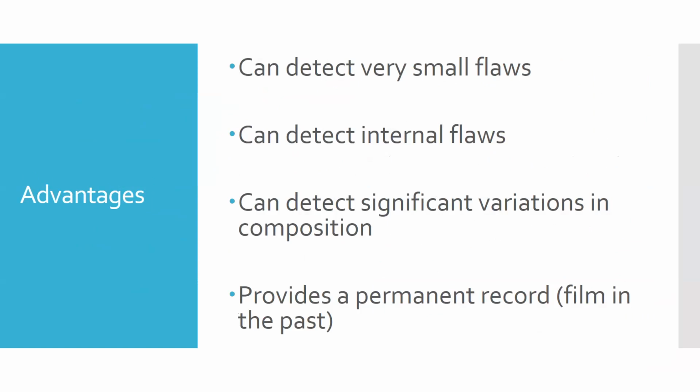And then in the past, originally this was all done with X-ray film. We used film as our detector source. And that created a relatively permanent record. Nowadays, we use an electromagnetic detection source hooked up to a computer, basically a panel that can detect X-rays, and that sends a signal. Now we get a computer file out of it, an image file for our computer. And that's pretty much what the industry is today. Almost everywhere has gone away from film.